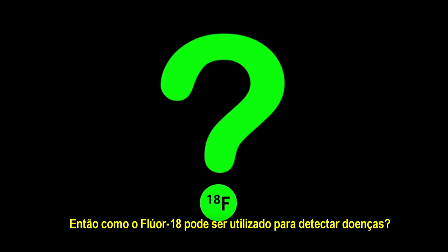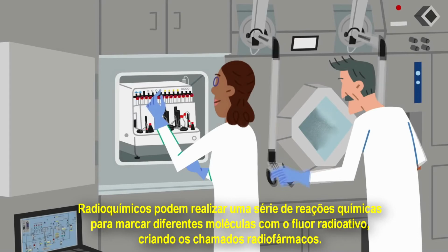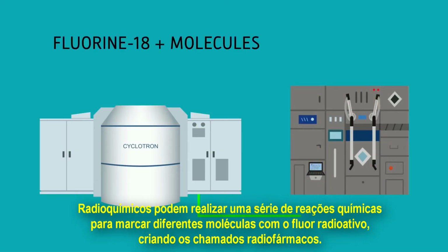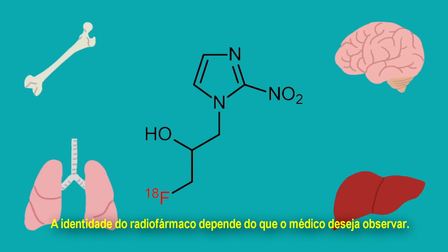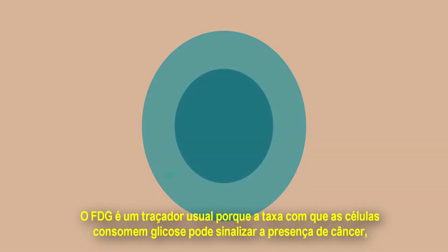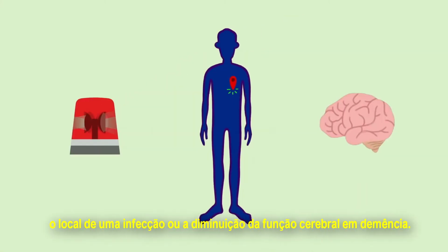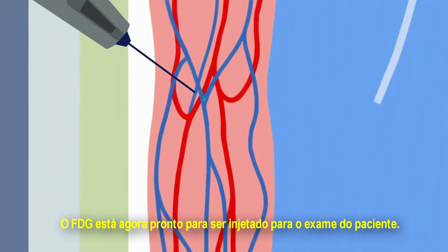So how can fluorine-18 be used to detect diseases? Radiochemists at the hospital can use a series of chemical reactions to attach the radioactive fluorine to different molecules, creating radiotracers. The identity of the tracer depends on what doctors want to observe. FDG is a common one because the rate at which cells consume glucose can signal the presence of cancer, the location of an infection, or the slowing brain function of dementia. The FDG is now ready for the patient's scan.